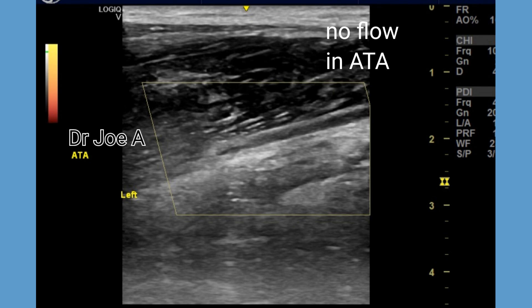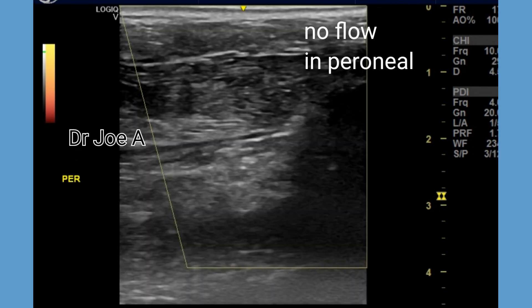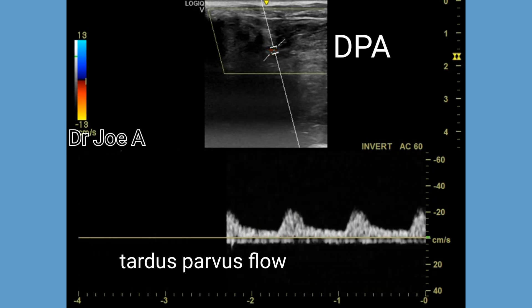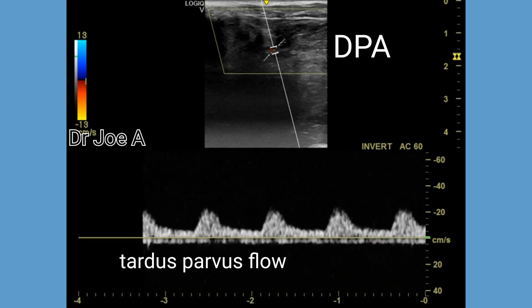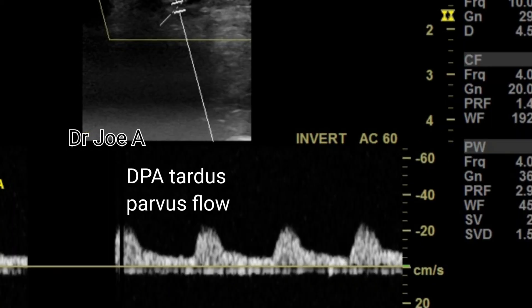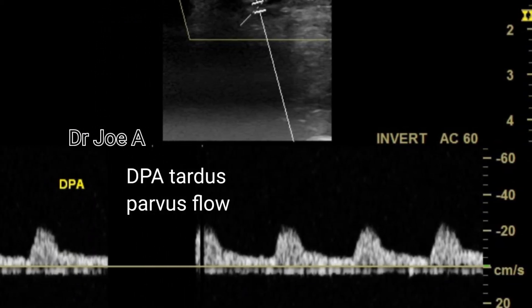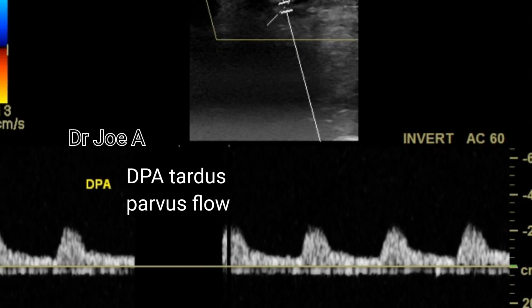There is no flow in the anterior tibial artery. There is no flow detected in the peroneal artery. The dorsalis pedis artery shows markedly dampened tardus-parvus flow, possibly supplied by collaterals.